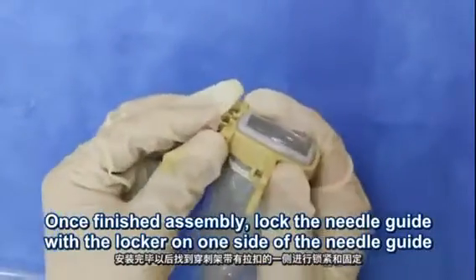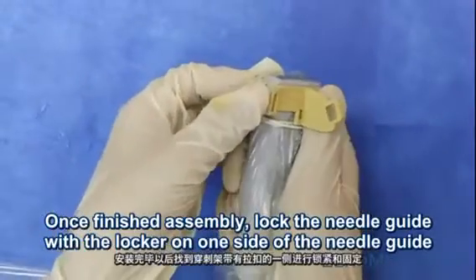Once finished with the assembly, lock the needle guide with the locker on one side of the needle guide.